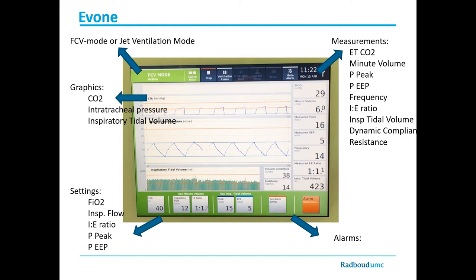As you can see, the use of this machine is totally different from a normal anesthesia ventilator. Minute volume is mainly determined by flow rate. In regular use, IE ratio is set 1 to 1, and minute volume is then half of the set flow. The settings don't involve respiratory rate, but respiratory rate depends on the set pressures and flow rate, and of course lung compliance.